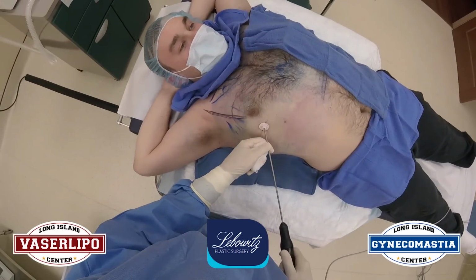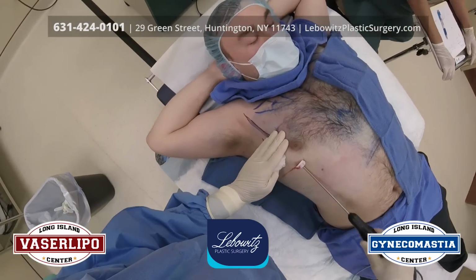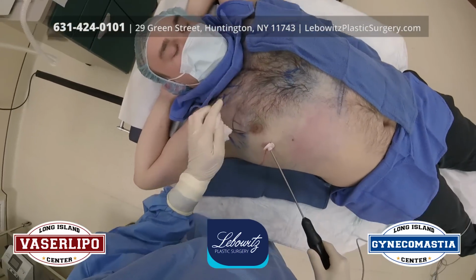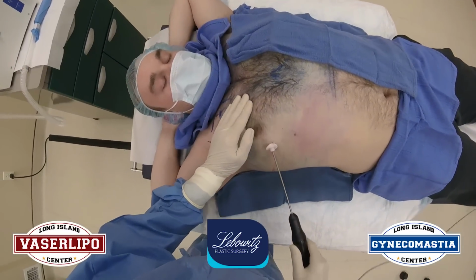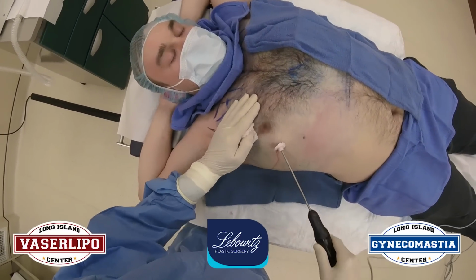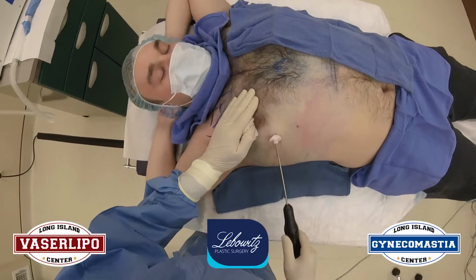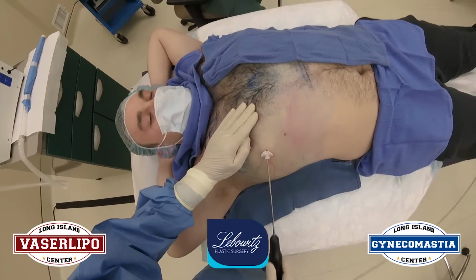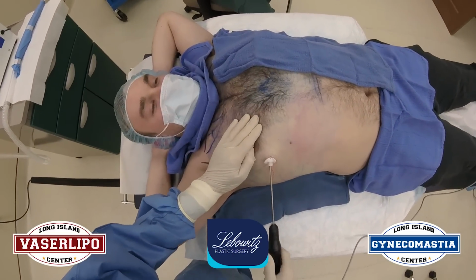And here we go. Put it right through that port, and you can hear the sound. It's ultrasound, almost like an electric ultrasound toothbrush. You can feel me kind of hitting that ground zero gland right there. I'm hitting it. And this makes a hamburger into a slider. A hamburger into a slider.